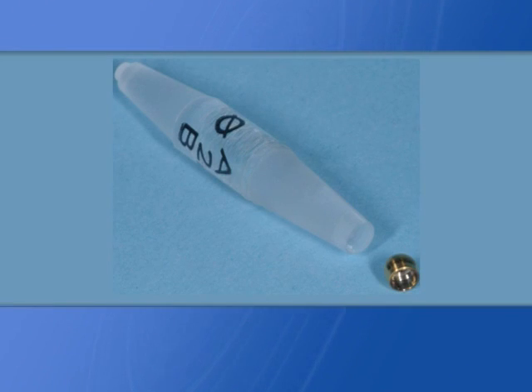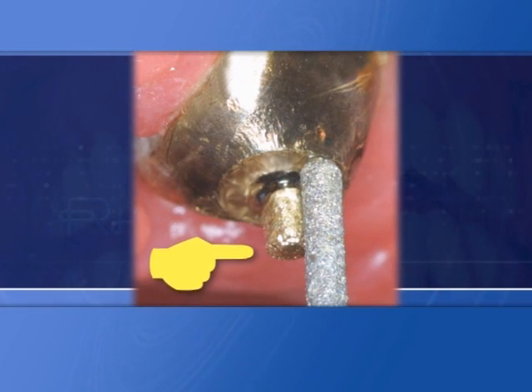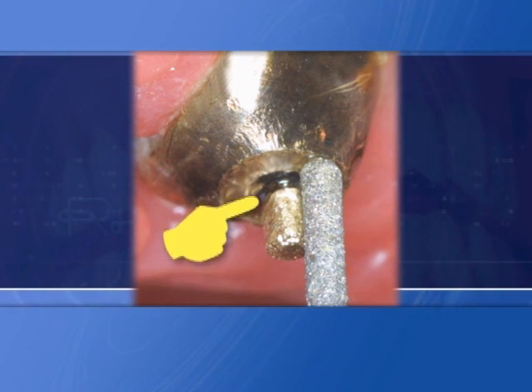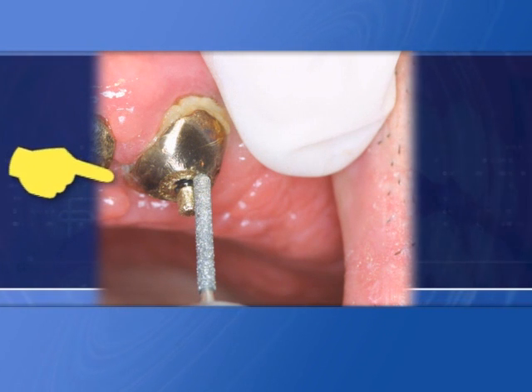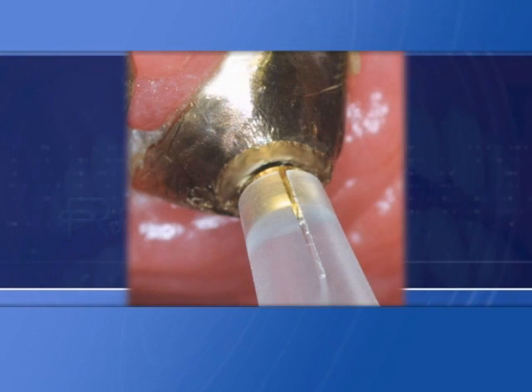Prepare the worn sphere, reducing it until the new concave sphere fits perfectly. Use the plastic tool and kit to handle the concave sphere. Be careful not to reduce too much of the worn sphere, losing retentive undercuts around the base. Grind carefully the worn out sphere around without reducing too much, trying often to fit the new concave sphere over it until it fits.